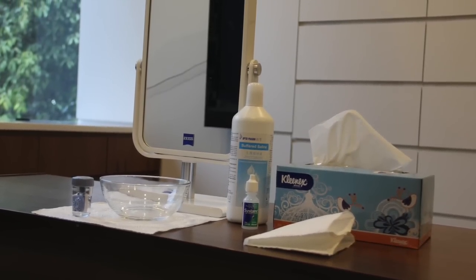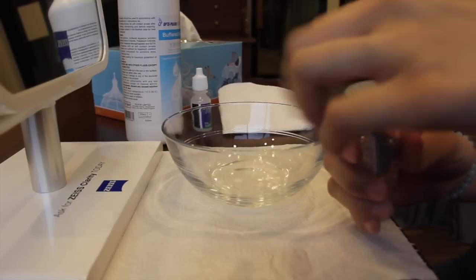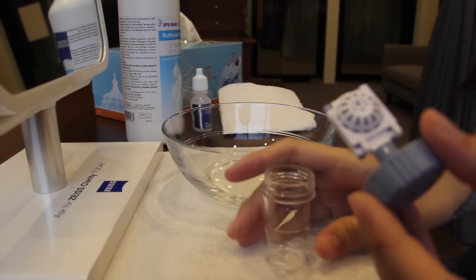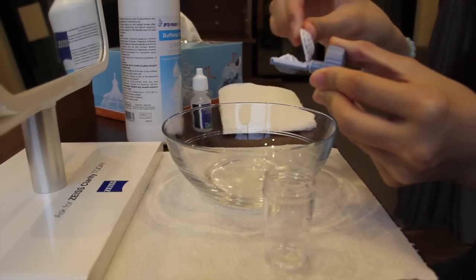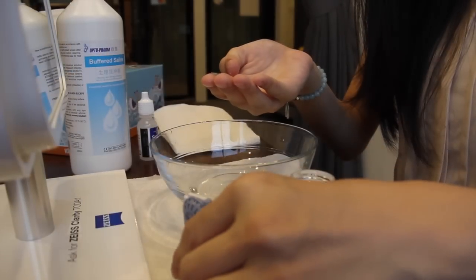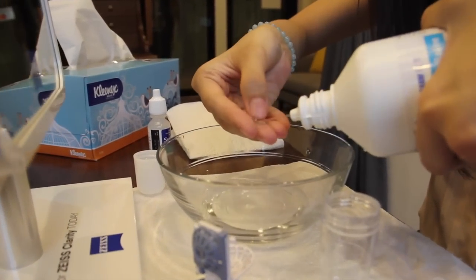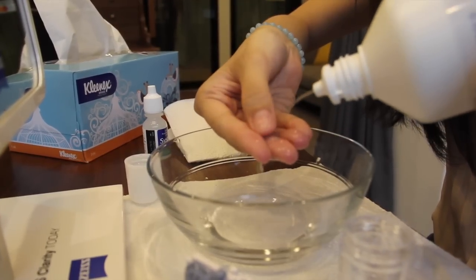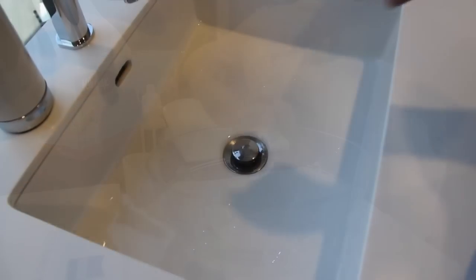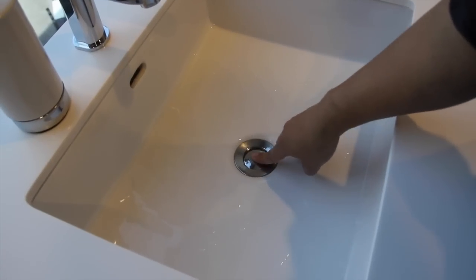Here is an idea of how you can set up before lens insertion. Firstly, open the case, pour out the solution, and remove the lens from the case. Gently rinse the lens thoroughly with saline. Remember to add a stopper to the sink drain if you are doing it over the sink — this will keep your lenses from going down the drain if you accidentally drop them.